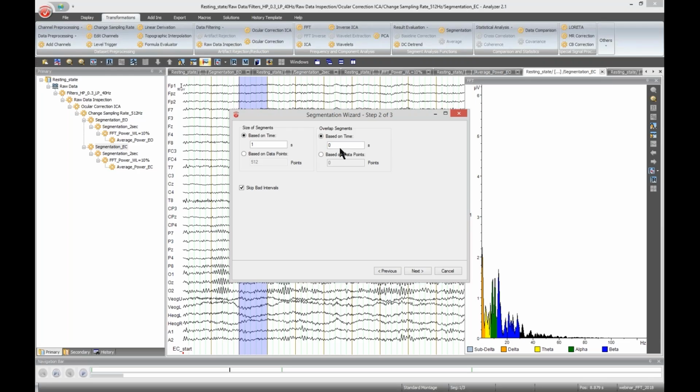How do I know what resolution is appropriate? That's also a good question. Selection of frequency resolution depends on how fine or coarse you would like to analyze the spectral content of your signal. For example, if you'd like to resolve frequency differences of 1 Hertz and not less, then the appropriate choice of frequency resolution will be 1 Hertz.